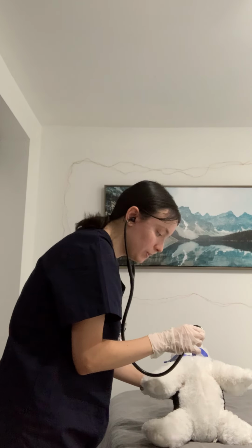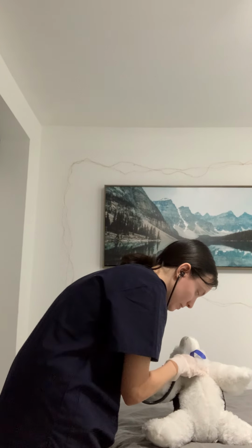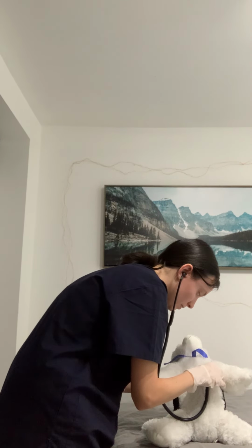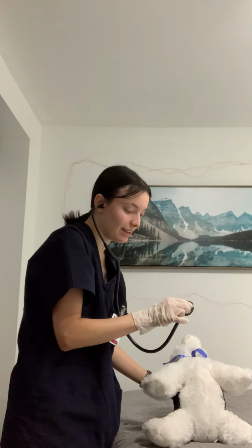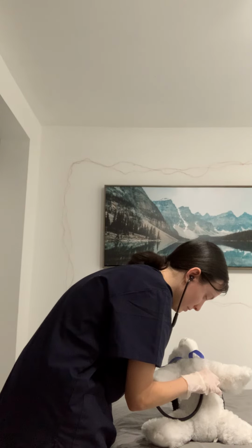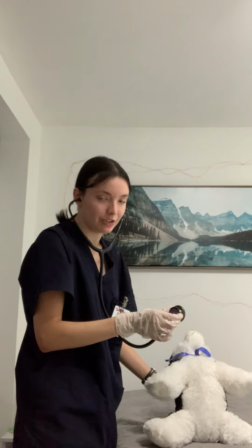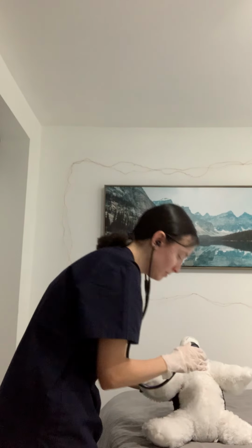Now moving on to Erb's point, which is on the left side of the sternal border in the third intercostal space. Now moving on to the tricuspid valve, which is on the left side of the sternal border in the fifth intercostal space. Now moving on to the mitral valve, which is on the left midclavicular line, and it's in the fifth intercostal space.